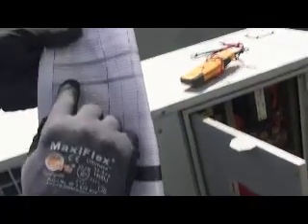So we also need to get the temperature of our pump. The temperature of our pump motor, we'll take a temperature probe and put it onto our pump and see what the temperature of our pump is. And Chris, you want to do that? Yeah. It's also on the tablet, right? Yes, and this is all on the tablet, yeah.